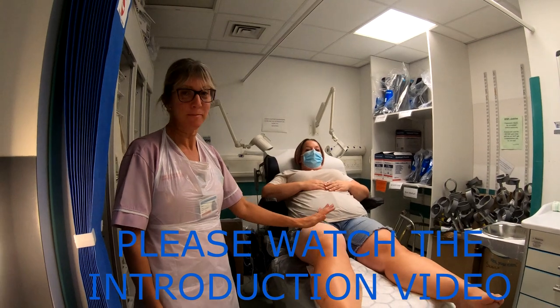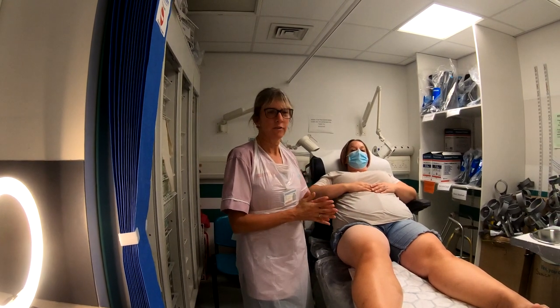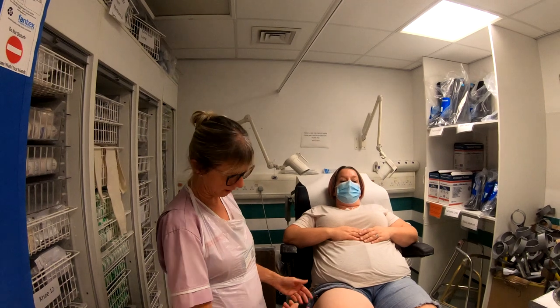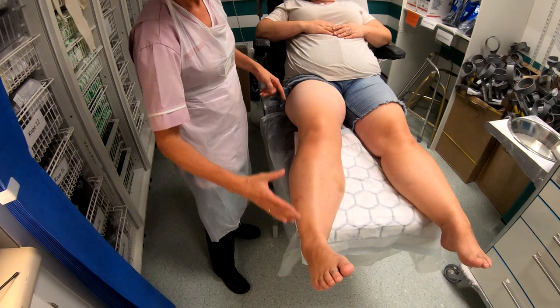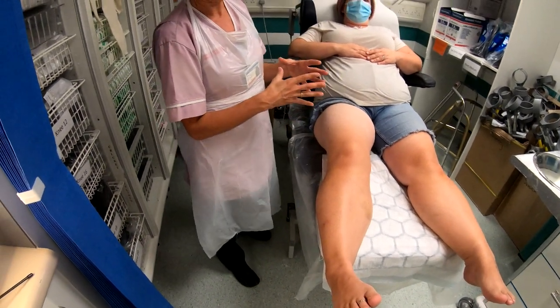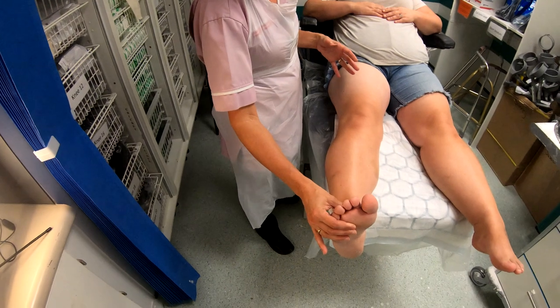We're now going to demonstrate an above-knee Plaster of Paris backslab. There are two ways of doing this — it's up to the individual. If you're doing a child or someone who's got very small stature, you can do this in one continuation backslab, from under the thigh all the way down under the foot, in one piece with two stirrups, one either side. If the patient is quite heavy, as most adults are, it can be quite tricky to concentrate on 90 degrees of the foot with no rotation.